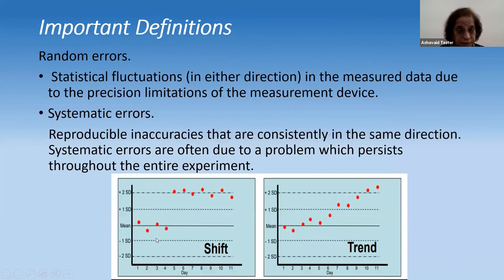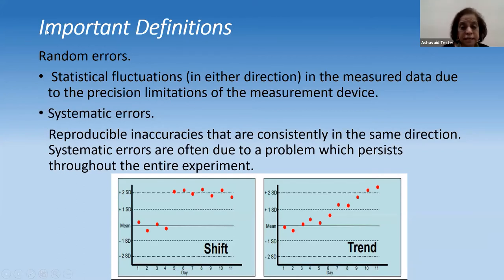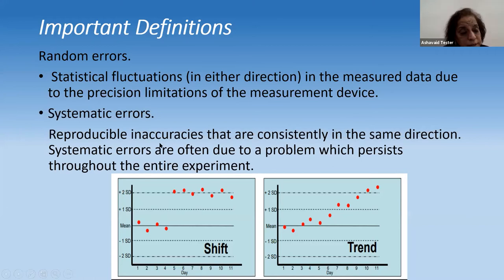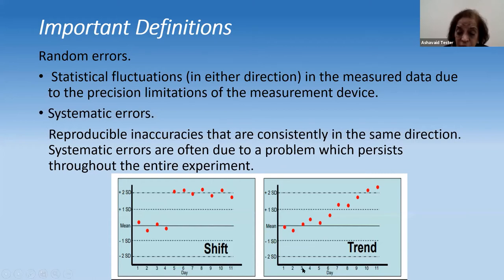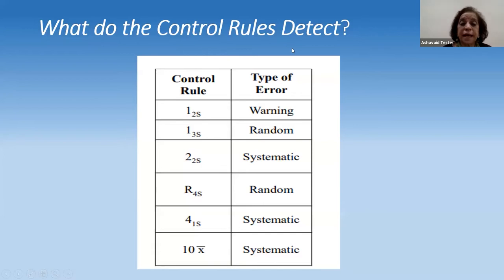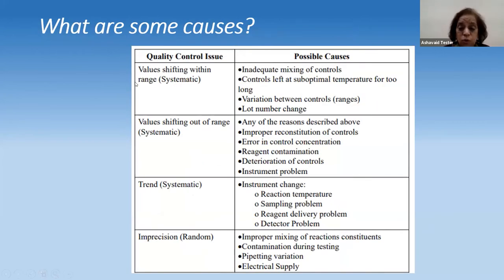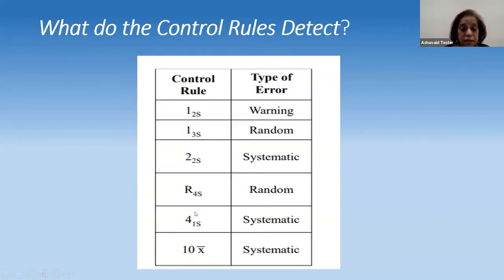Corrective action addresses errors which could be random or systematic. Random errors are statistical fluctuations — they could be in either direction — due to precision limitations of the measurement device. Systematic errors, on the other hand, are inaccuracies that are reproducible all the time; you get trends consistently in the same direction, often due to a problem present throughout the entire experiment. The control rules detect which type of error has occurred.